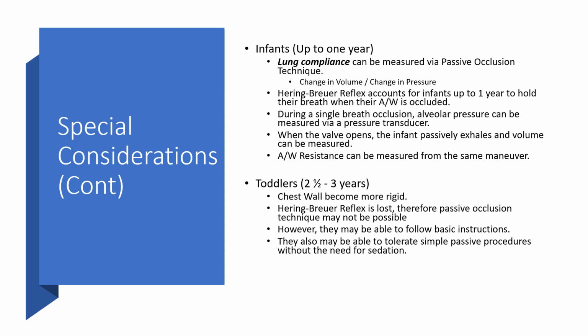During that single breath occlusion, alveolar pressure can be measured via a pressure transducer. So this is where we're using a natural, if you will, reflex to actually obtain some potentially useful values. When the valve opens, the infant passively exhales and volume can be measured. Airway resistance can be measured from the same basic maneuver.